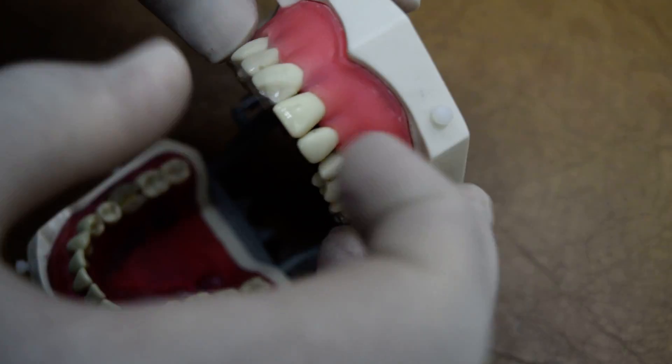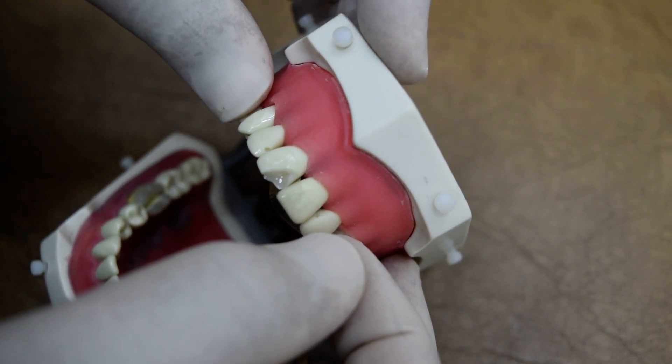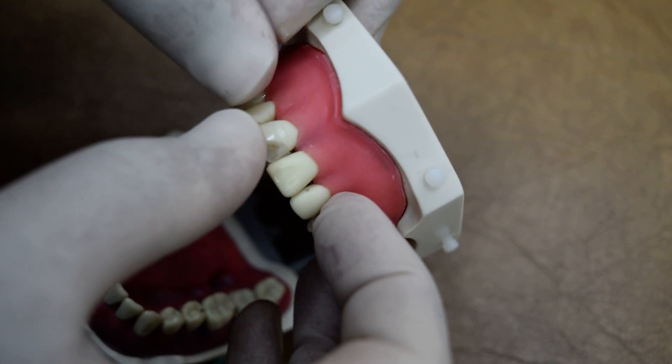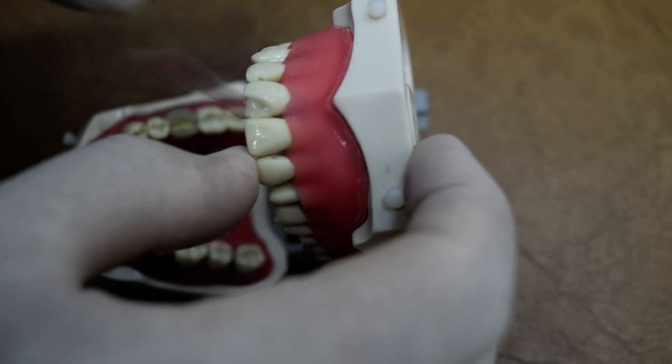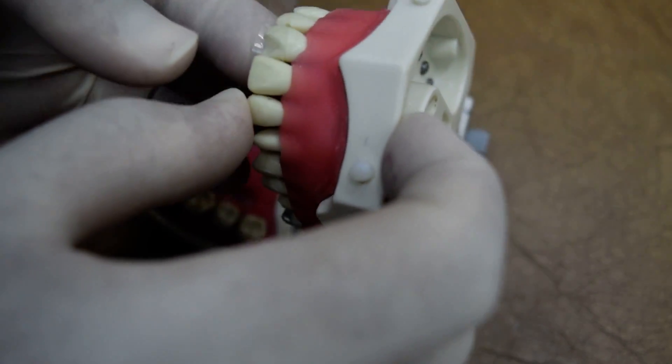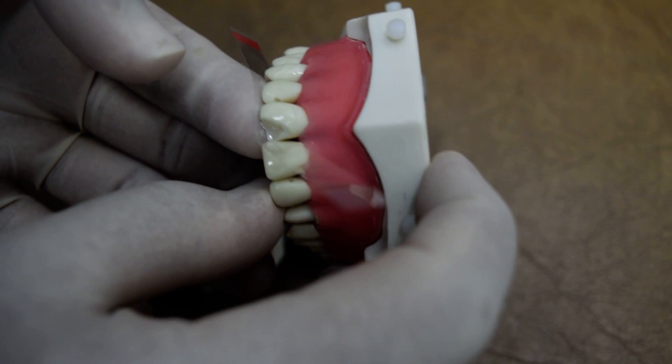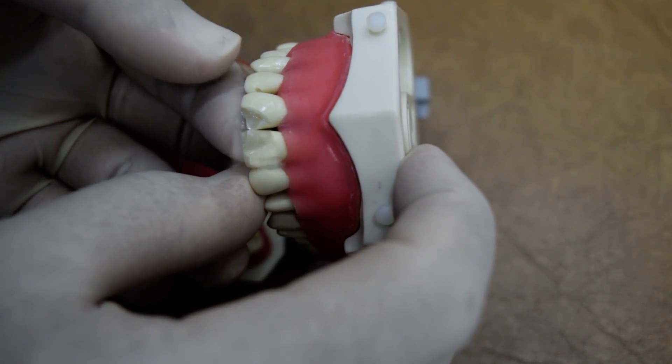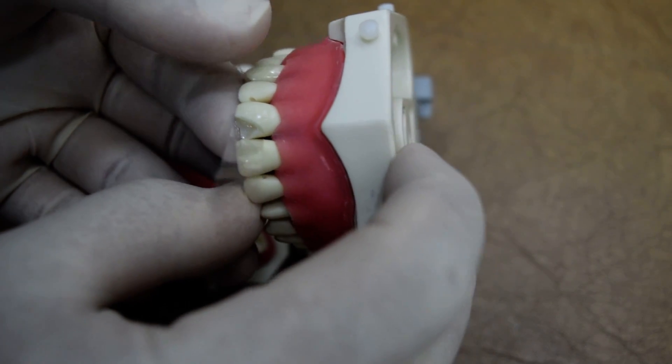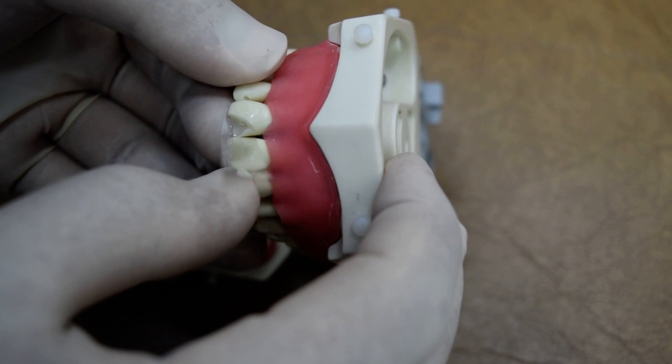As you can see here, the contact is already built, so we can put a wedge or we cannot, it's okay. I mean it's not necessary to put a wedge now because you are going to put only the labial layer with the incisal to build the incisal and labial surface.